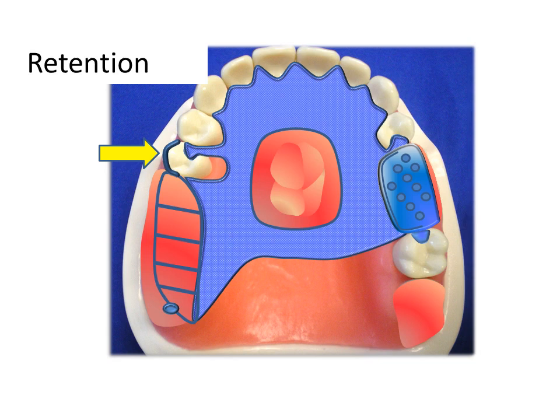Dr. Goon, could we use wrought wire? Yes, provided that there was a 0.02 inch undercut present. And what about number 15? On the tooth-bound side, the retentive area of 15 is located posterior to the fulcrum line, and aesthetics is rarely an issue. A standard half-round cast clasp engaging a distal 0.01 inch undercut is by far the simplest and easiest clasp to employ. If correctly made, these clasps tend to be very reliable.